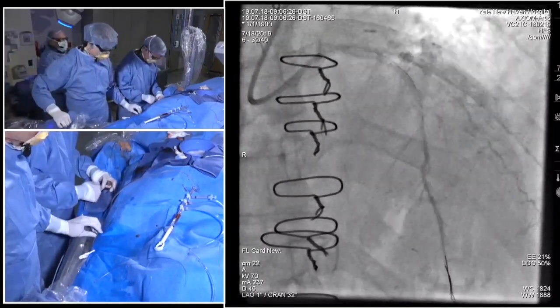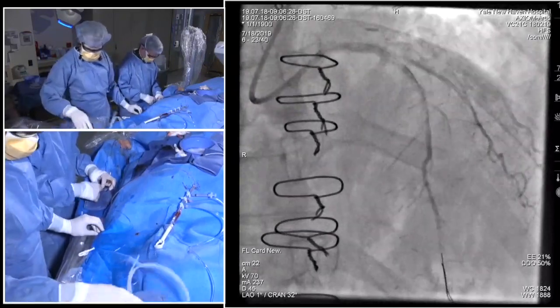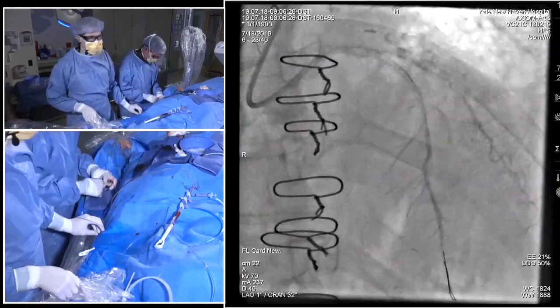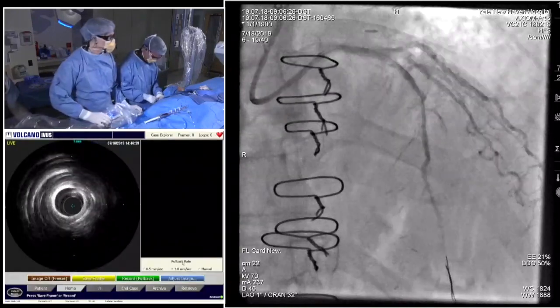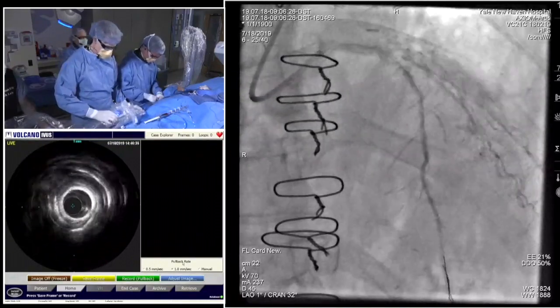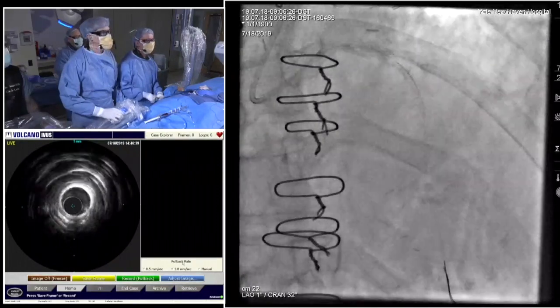No, I think that's great. Did you guys test the image? So the flow is slowly getting better. Yep. How much Neo, guys? What's the Neo? Or Levo? I just have fluoro to get a pressure up real quickly. Turn the image on.